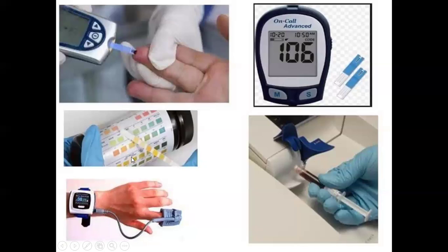This is a testing device for urine testing, which can analyze a lot of things like blood, the glucose level, the creatinine level, etc. And you have a strip with normal readings, and the color for each concentration is also given, which any layman can compare with the label given here with the color concentration and come to a conclusion about what the concentration is. And this is a glucometer. You keep a drop of blood to the strip and instantly you get the readings.